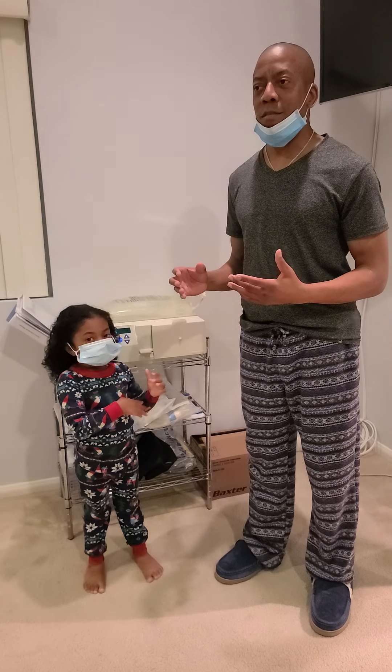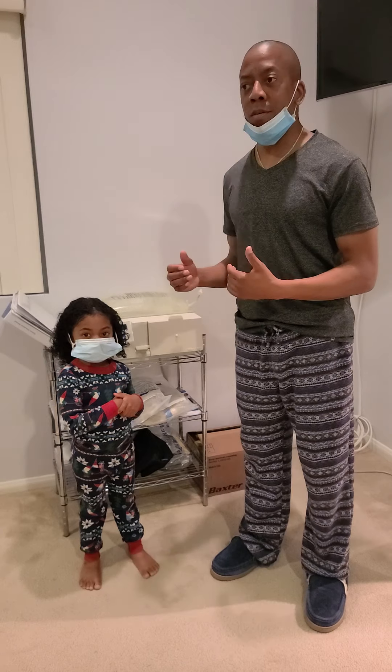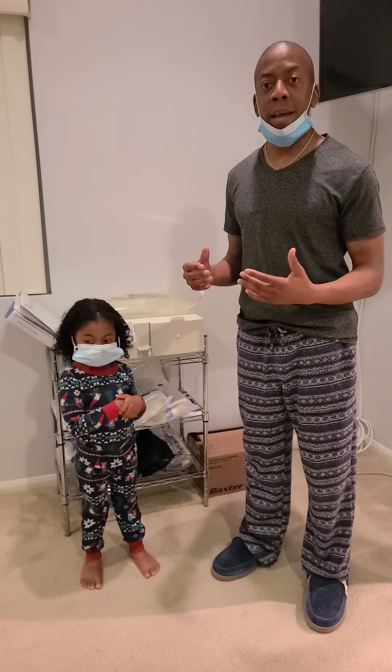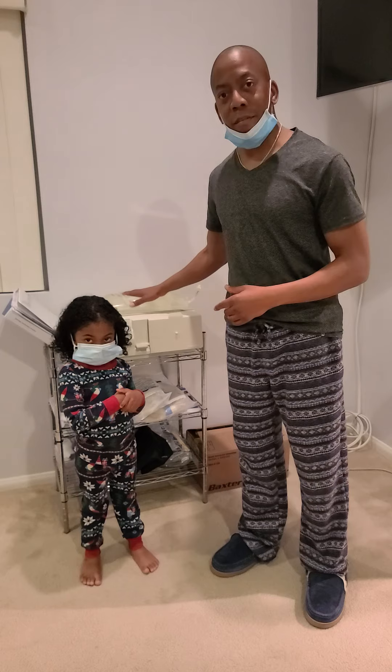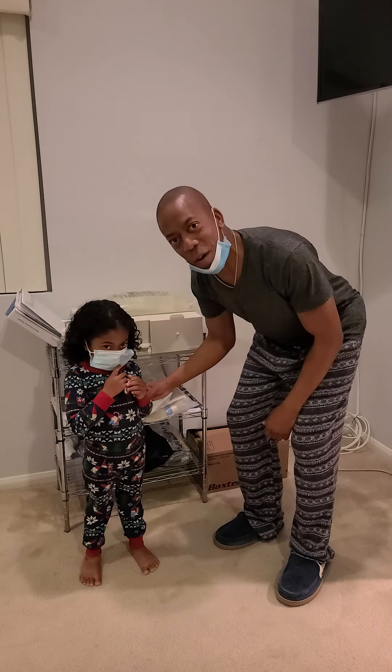A lot of times people wonder how challenging it is or what it's like. I myself had classes to go to, but although the classes were great, they didn't really show the process of what to do to connect everything. So we're going to go ahead and do this. I've got my little assistant here, Zane, who's going to help us.